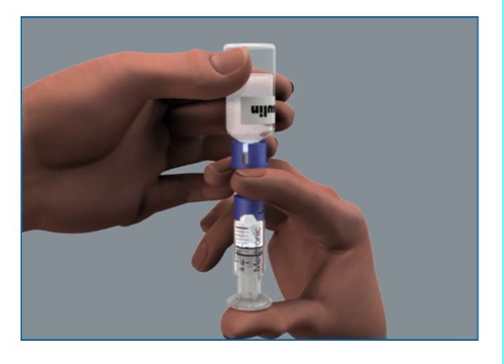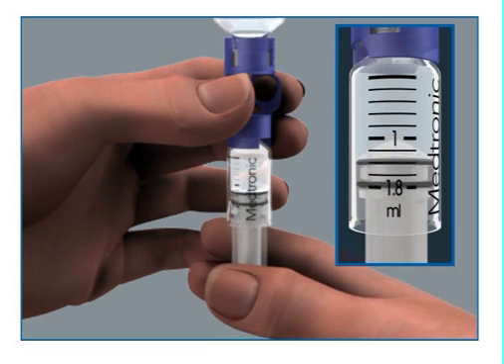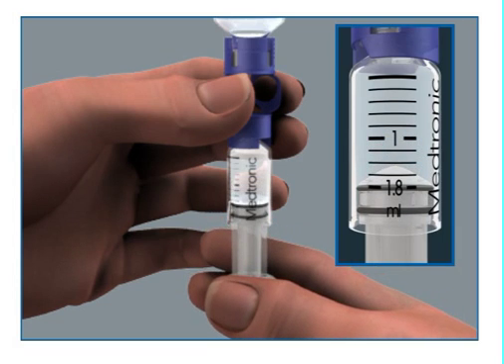When the reservoir stops filling, slowly pull down on the plunger until the top black o-ring lines up with the desired amount. Keep in mind every small line on the reservoir represents about 20 units of U100 insulin.